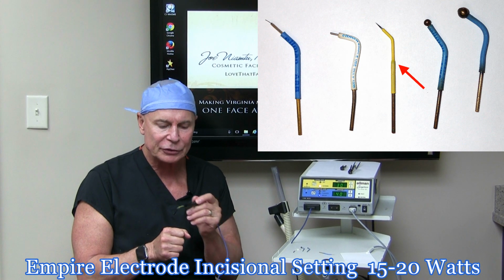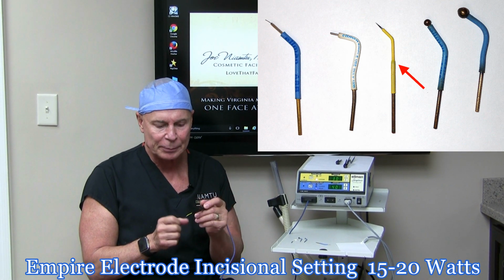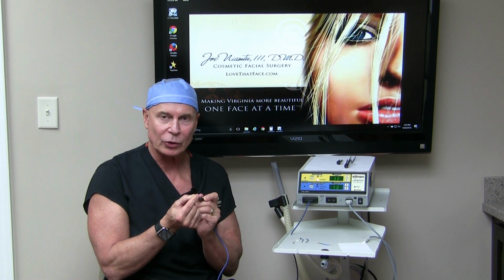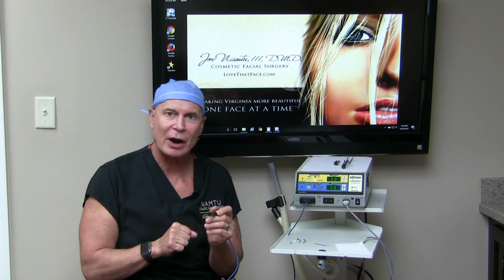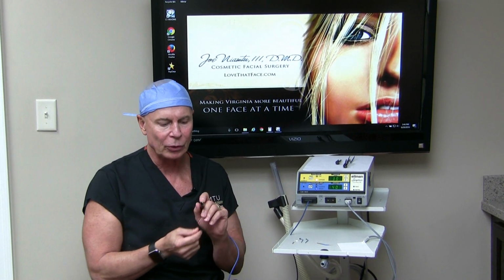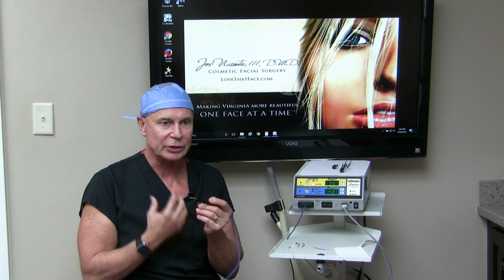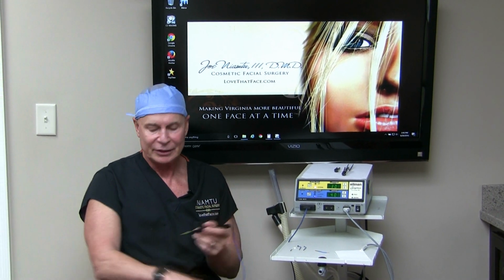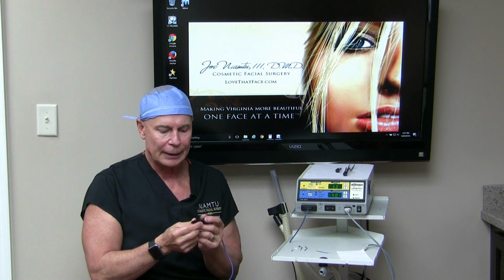However, if you do that, you have to use just the tip, because if you go deeper, the electrode is wider. And this is a very rigid electrode, where the very tip is a fine wire electrode. So again, this is a general purpose electrode. You can use it in the mouth, people use it for labiaplasty, and you can use it for skin lesions.